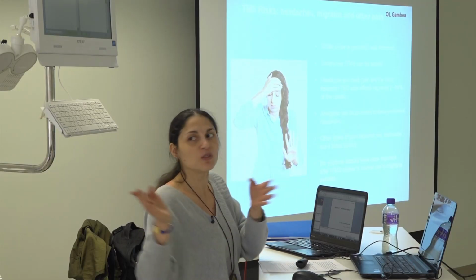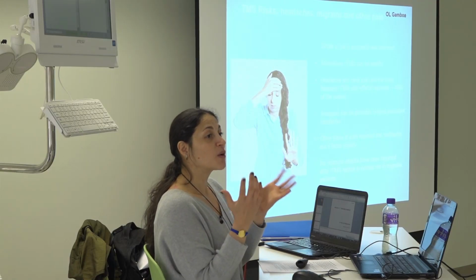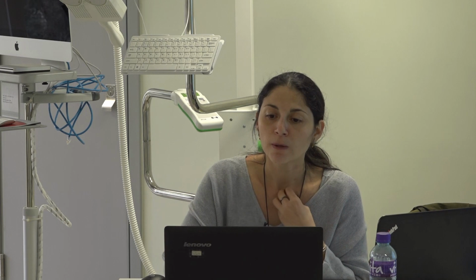So we can do some testing here and see how you feel it. But as I said before, when you are going to do a test and check if you are suitable for TMS, test it on yourself, on your hand or wherever, just to see how it feels, because it can be really painful. Then you can understand what the participant is going to feel during stimulation.